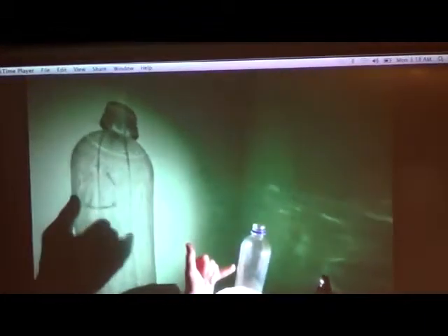Positioning my light source right in the middle will give me the AP view. Rotating it 90 degrees from AP will give me the lateral view. Something in between AP and lateral is the oblique view. The line that we see at the back of the monitor is the middle line. It is an analog of the spinolaminar line.